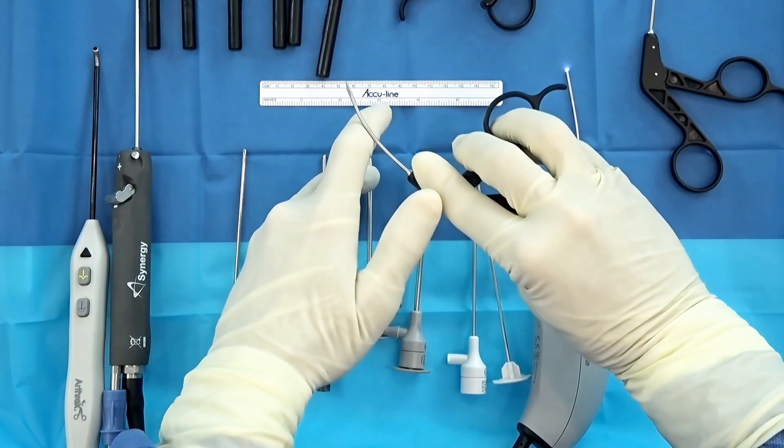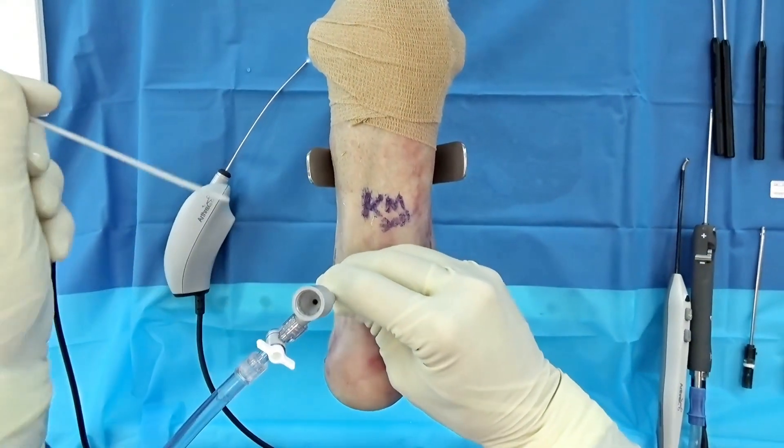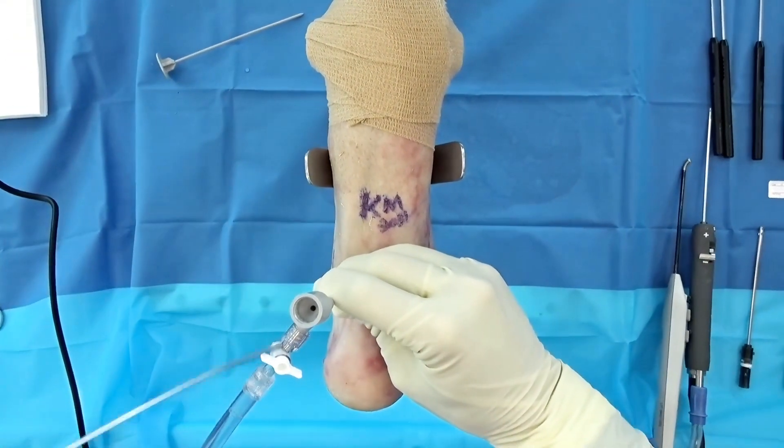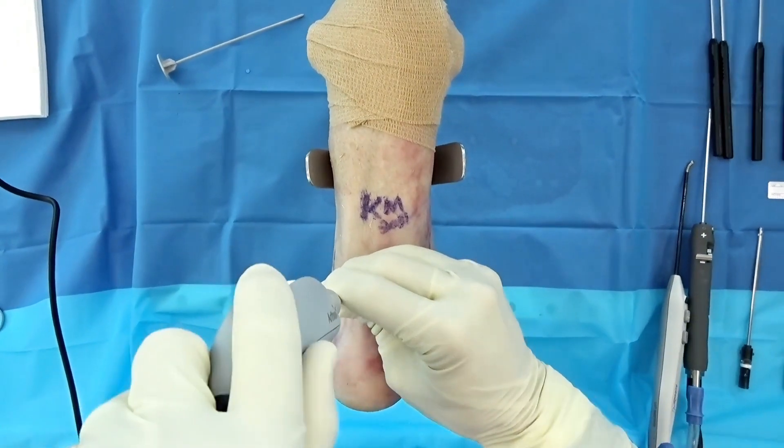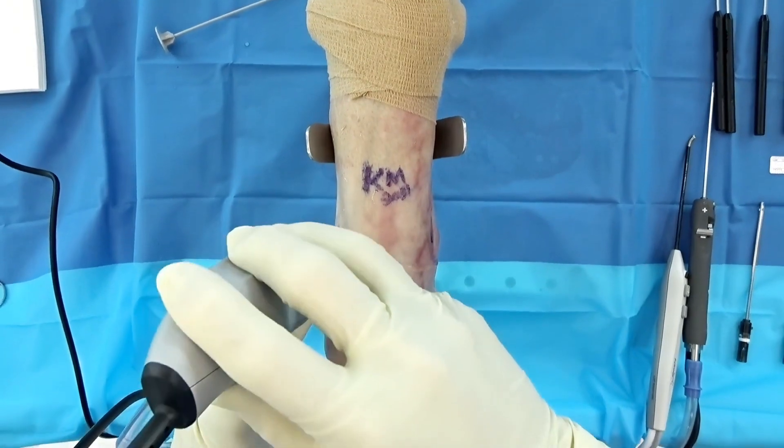We've already created our posterior medial and posterior lateral portals using the nick-and-spread technique for safety. The portal goes in, I hold it, we pull out our blunt, and then the camera goes in. The Nano pops in really nicely. Turn your flow on.